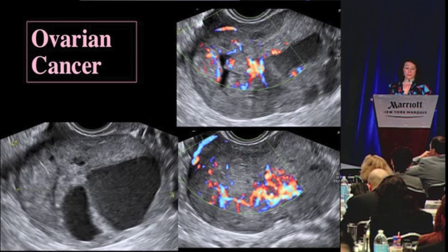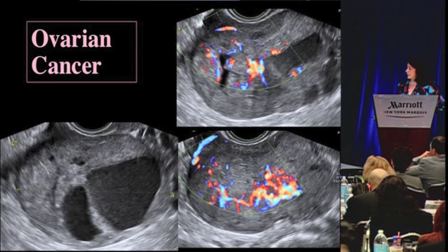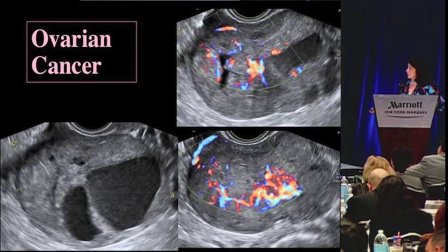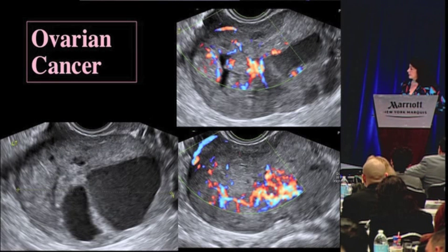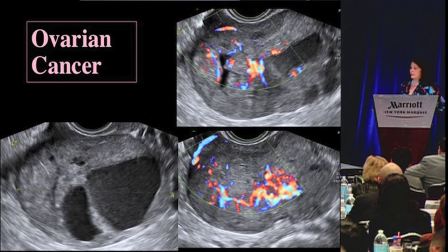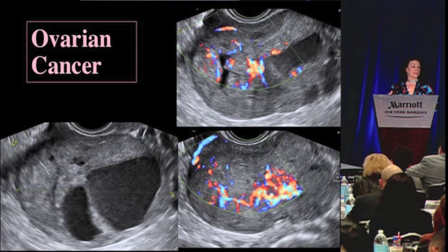This is a mass by ultrasound. It's a mass that has some cystic areas, you can see here, and some solid areas. And if you turn on the color flow Doppler, you can see blood flow within these solid areas. That's a lot of blood flow, very disorganized. Tumors have a lot of disorganized angiogenesis and a lot of blood flow.